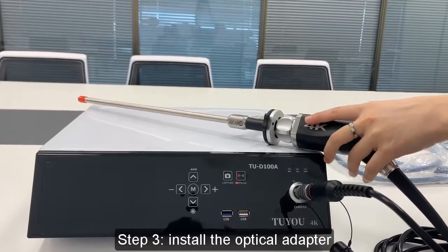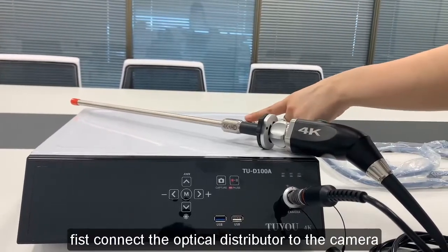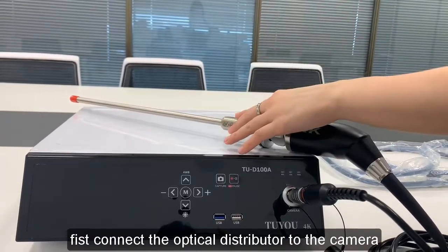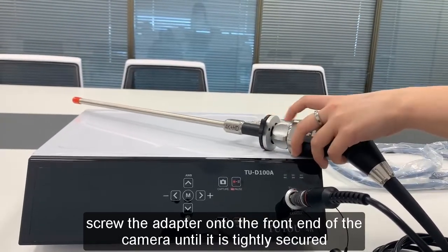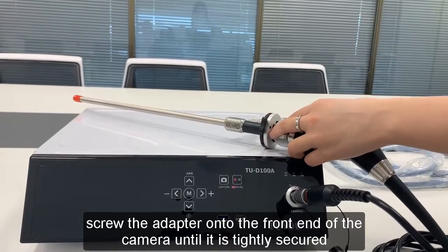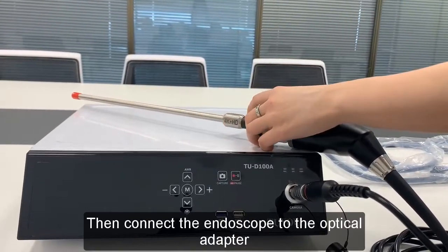Step 3: Install the optical adapter. First, connect the optical distributor to the camera. Screw the adapter onto the front end of the camera until it is tightly secured. Then connect the endoscope to the optical adapter.